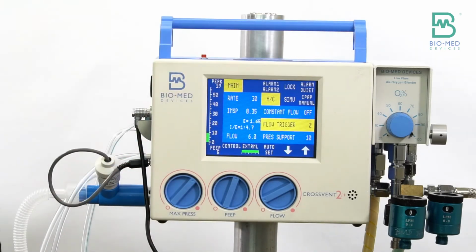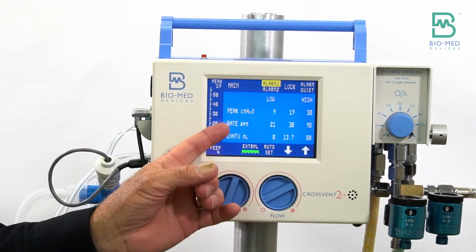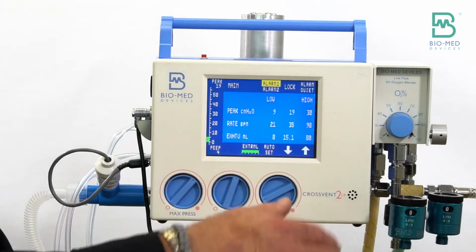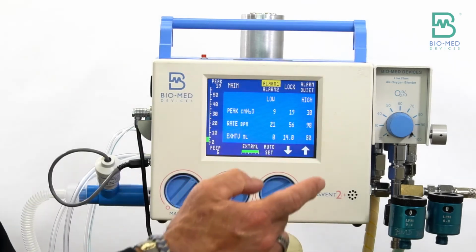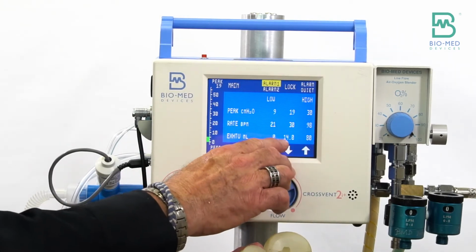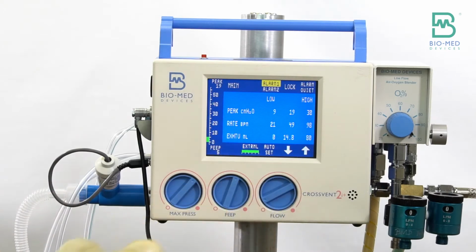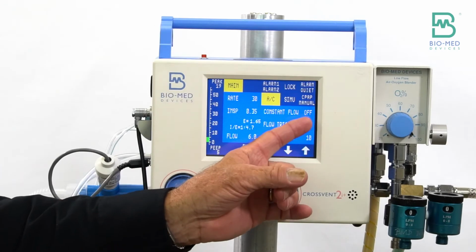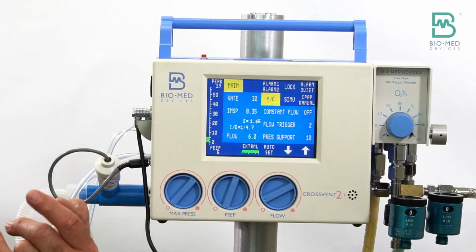Now, when you have the flow sensor in and you look at these alarm screens, see alarm 1, now we have a rate, and so the middle column on rate is going to show you your actual rate, and you can set alarms around that. The middle column on volume is actually showing your tidal volume for each breath. In this case, I'm getting, say, 14. Like I said, we don't show a leak percentage like some of the ICU vents do.